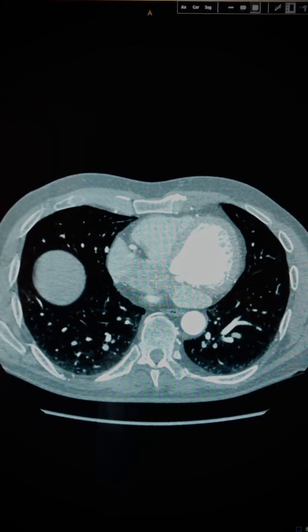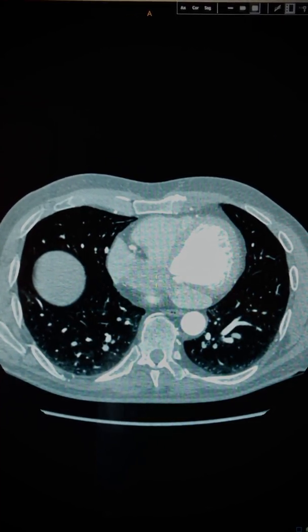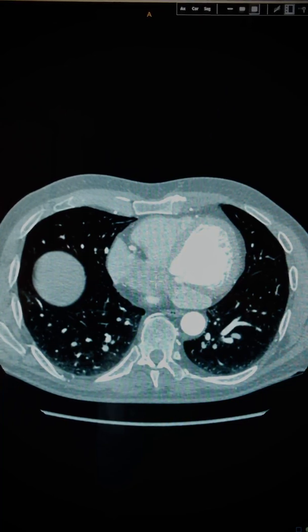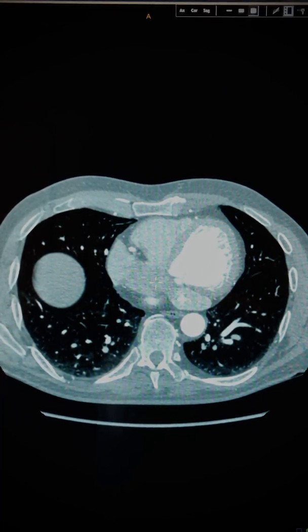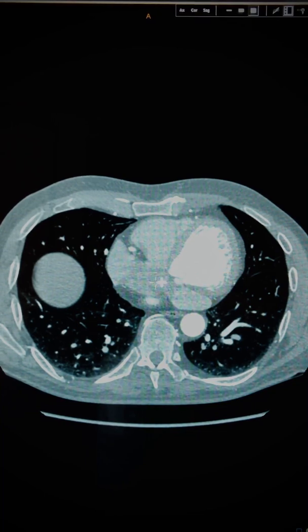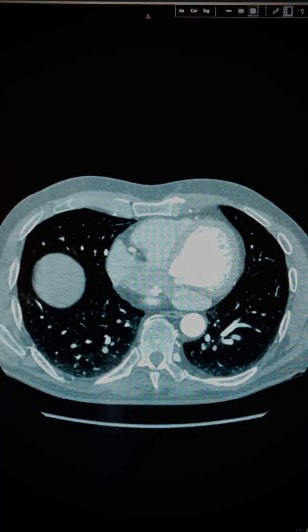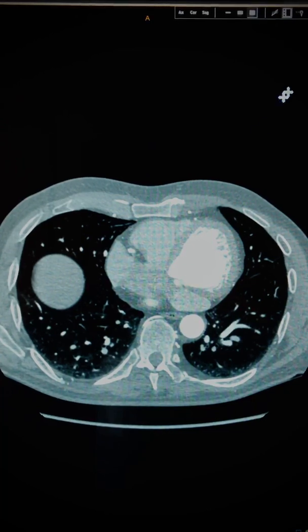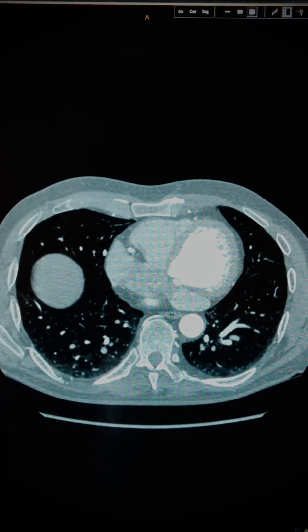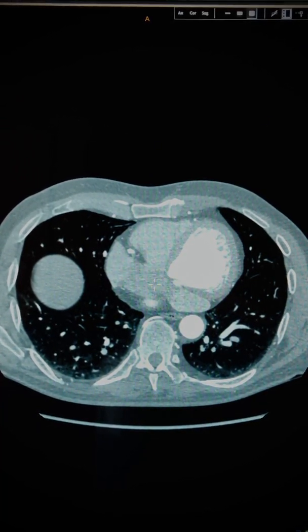This is a dilated coronary sinus. The coronary sinus is a vein that drains into the right atrium. There are many reasons for a dilated coronary sinus, some of which are highlighted on the links below.